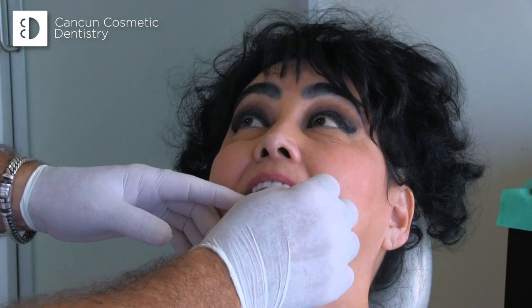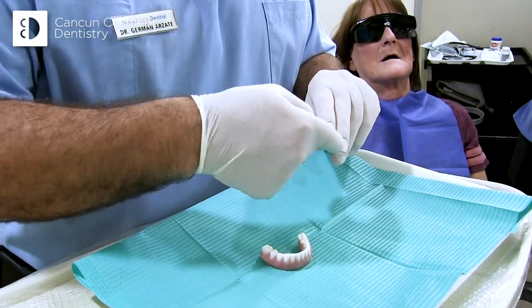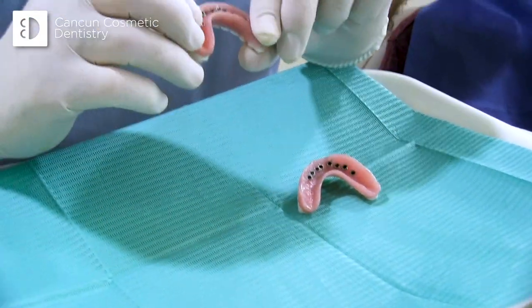How do you feel? Good. They have here housings and o-rings. Then we remove part of the palate.